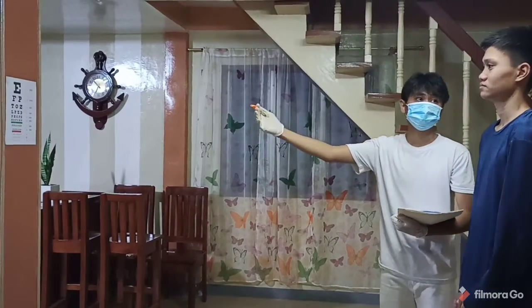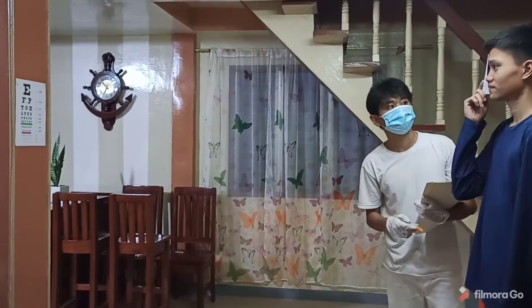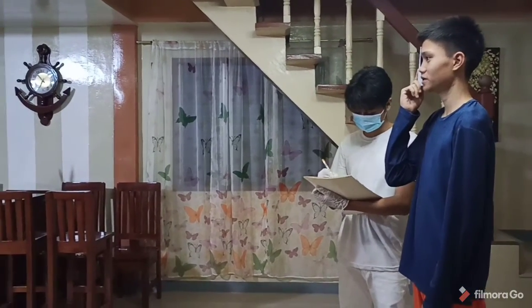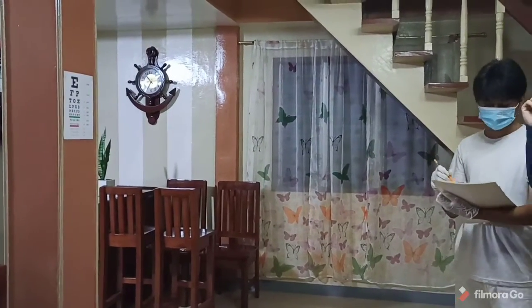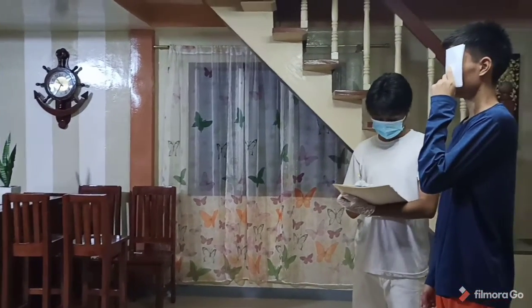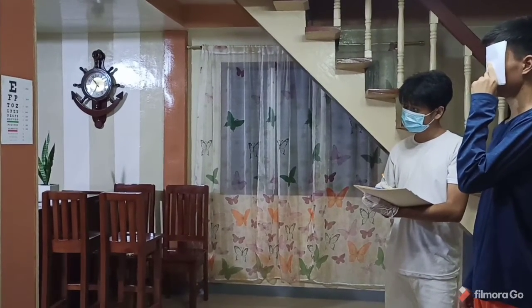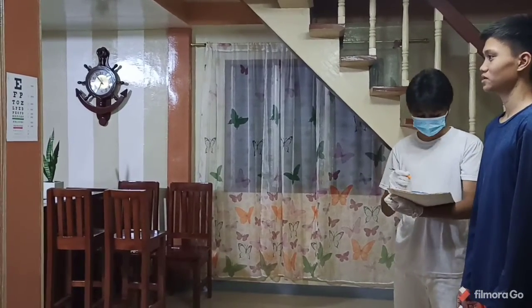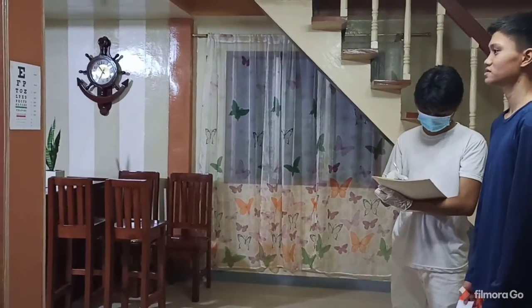Can you read those letters, sir? Let's start from the top, sir. Cover your right eye, sir. First. E, F, P, T, O, Z, L, P, E, D, P, E, C, F, D, E, D, F, C, Z, P. Okay. And cover your left eye, sir. E, F, P, T, O, Z, L, P, E, D, P, E, C, F, D, E, D, F, C, Z, P. And both eyes, sir. E, F, P, T, O, Z, L, P, E, D, P, E, C, F, D, E, D, F, C, Z, P.